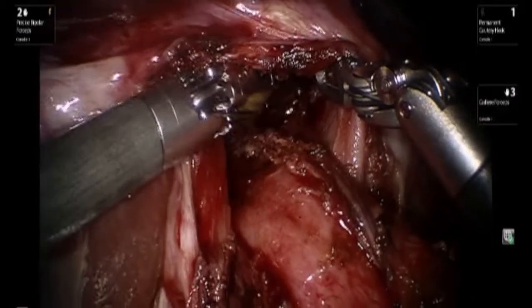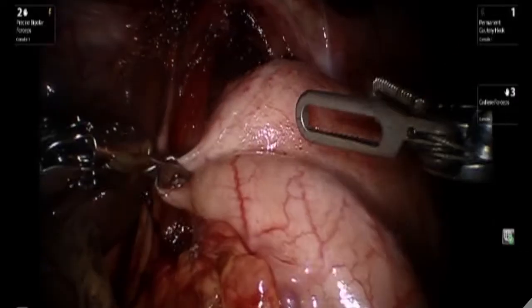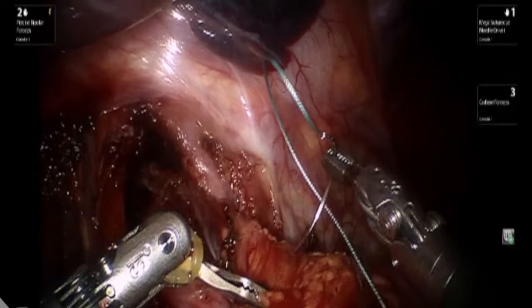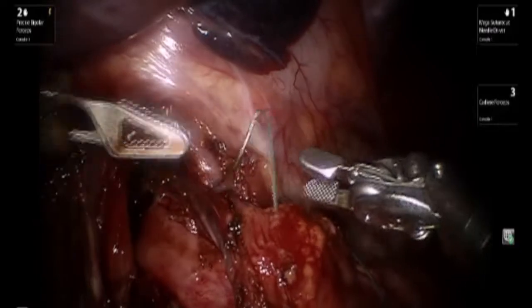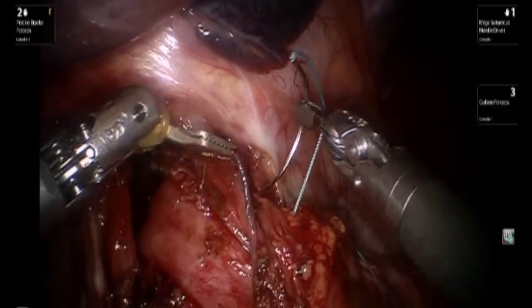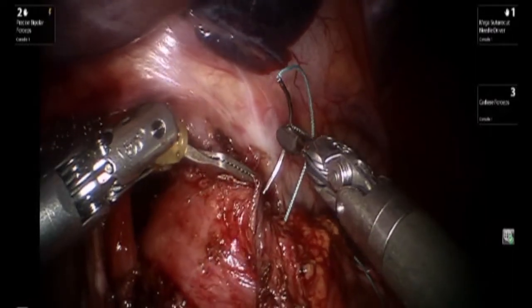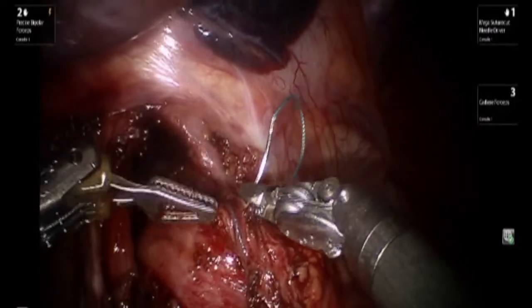Demonstration of the vagus nerve, which is preserved and left intact. A Dor fundoplication is performed in conclusion, with multiple bites taken of the gastric aspect and incorporating the cut edge of the myotomy. Great care is taken not to pass through the mucosa at this stage.